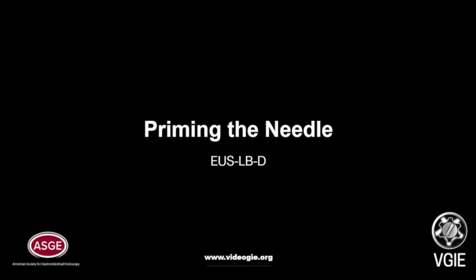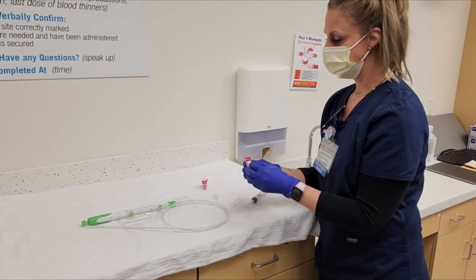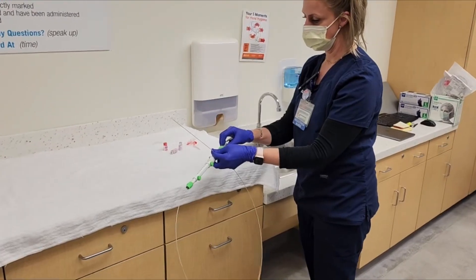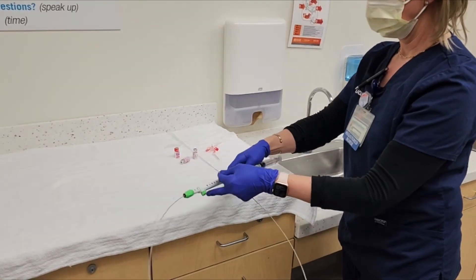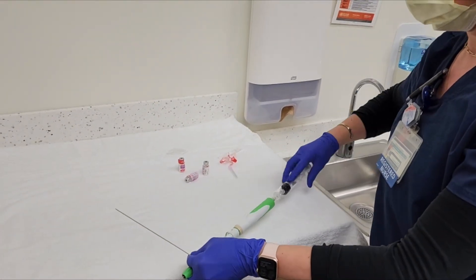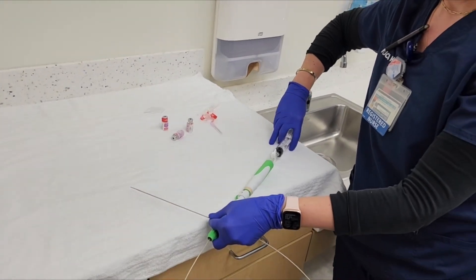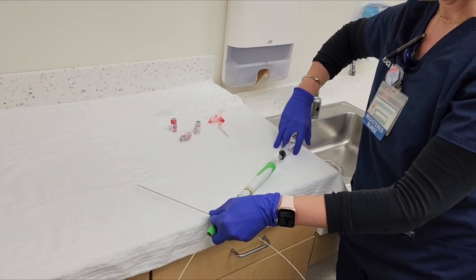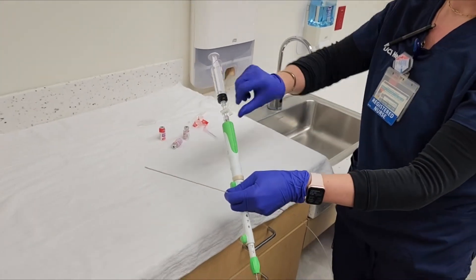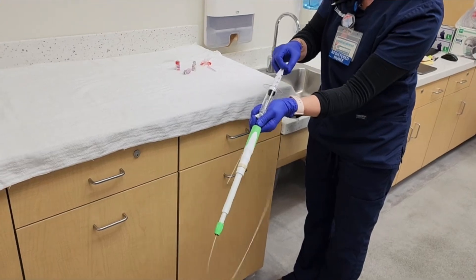The first step is priming the needle. We prime the needle with 3 cc's of heparinized saline. With the heparin drawn up into the syringe, we attach the syringe to the FNB needle. We advance out the needle and flush through the needle until a few drops leave the tip. We then apply suction to the syringe.